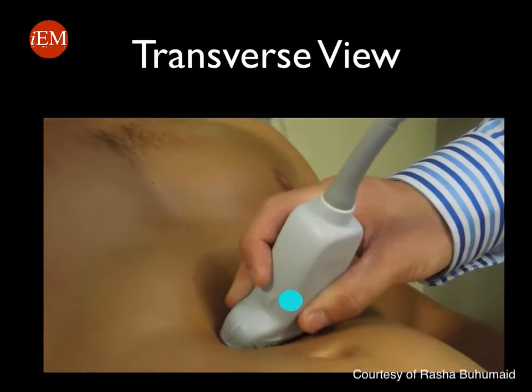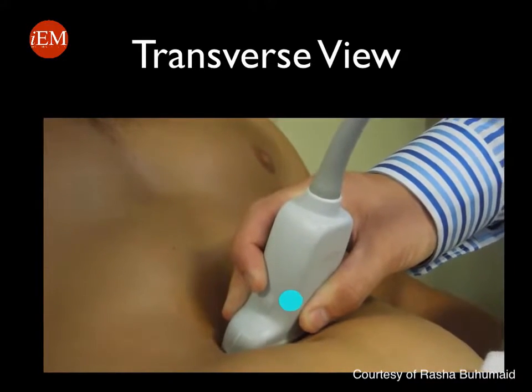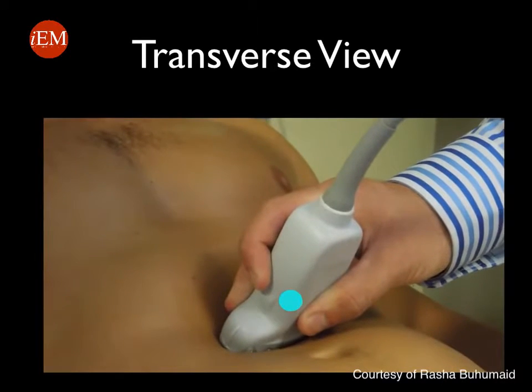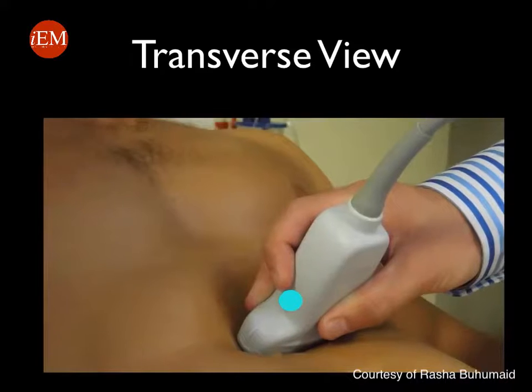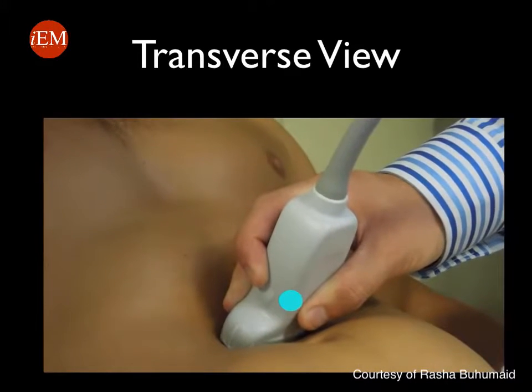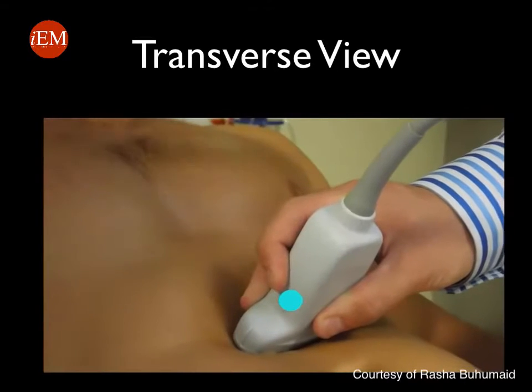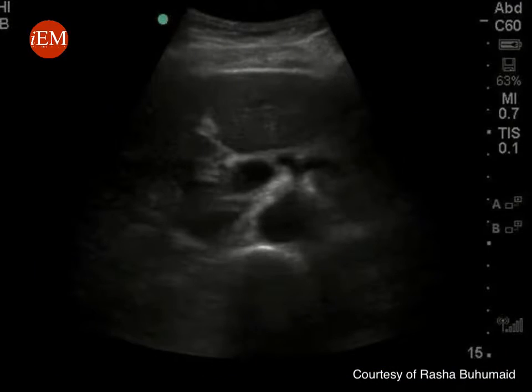You will start at the subxiphoid area, with your probe in a transverse plane, probe marker towards the patient's right. You will identify the abdominal aorta and slide the probe towards the umbilicus until you visualize the bifurcation of the aorta. This is the corresponding ultrasound image.